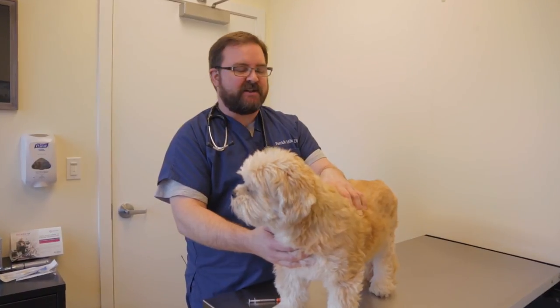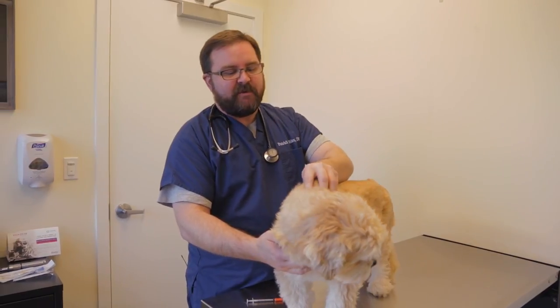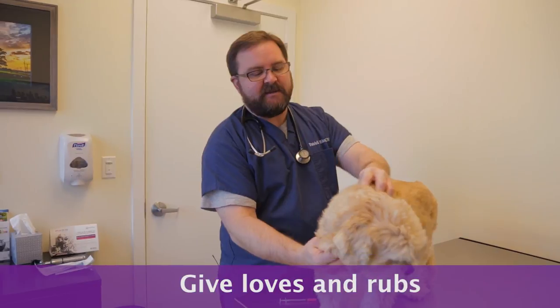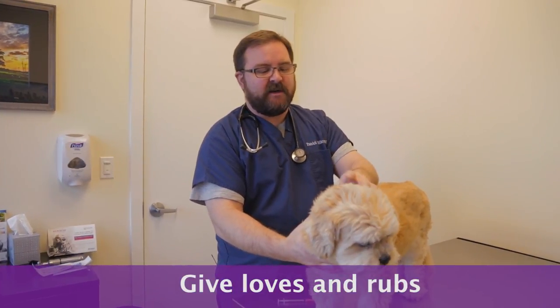Some pets are a little bit more sensitive about getting those insulin injections, and it's a little bit of trial and error finding areas that tend to be less sensitive versus others. But what I'll do when we're drawing this up is basically just kind of pet them, rub on them, so they actually think that they're just being loved on.